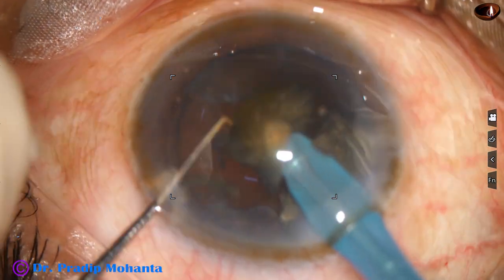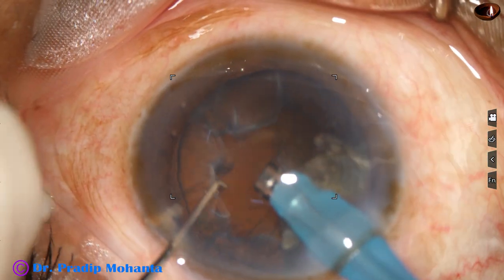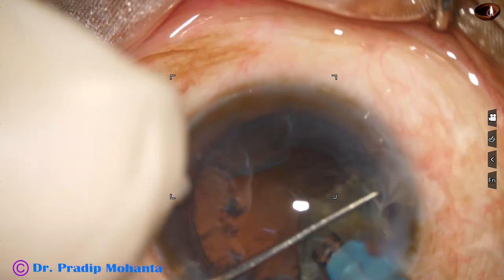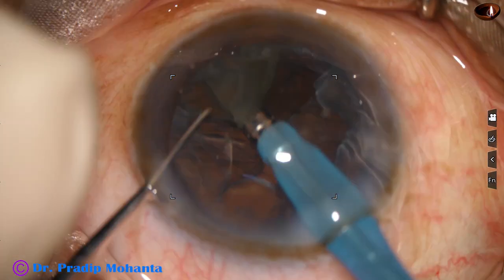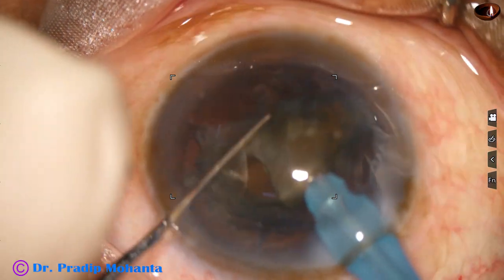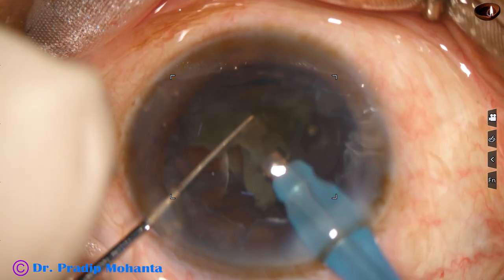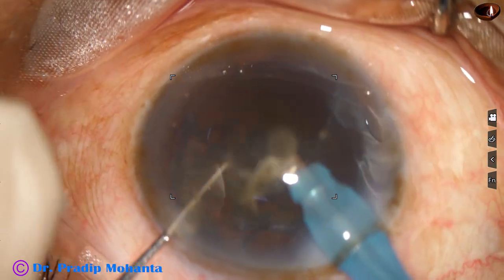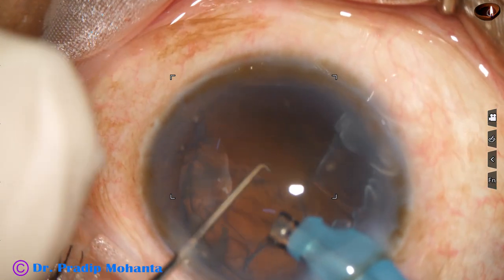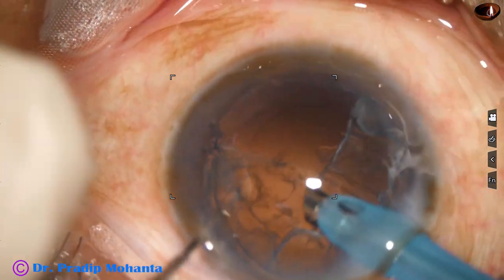This is a grade 4 nuclear sclerosis — the nucleus is quite hard. So I am using about 80% ultrasonic energy. Vacuum is 450 from the very beginning and flow rate is 45 ml per minute. This is a totally unedited recording of this surgery.